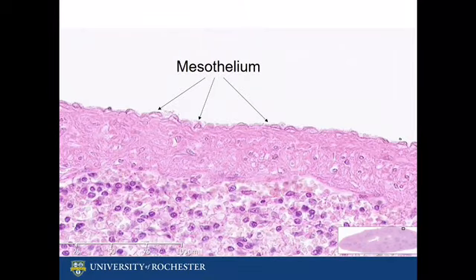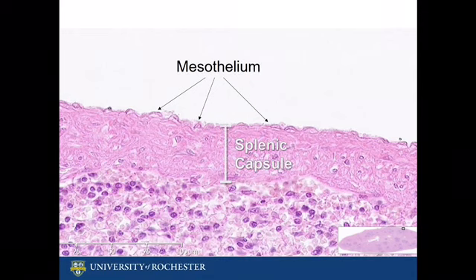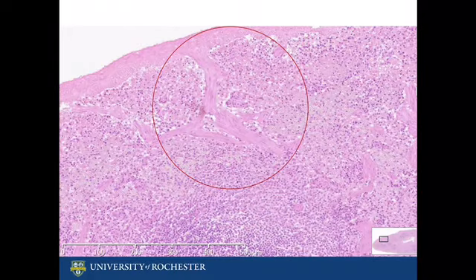The very outside of the spleen consists of a thin layer of mesothelial cells. This thin layer surrounds a thicker fibrous layer of connective tissue and muscle cells known as the splenic capsule. Together, the mesothelium and capsule form the outer surface of the spleen. Some muscle tissue extends from the capsule wall deeper into the spleen, forming trabeculae that interface with the inner pulp.